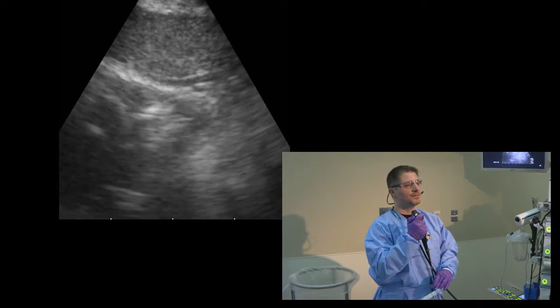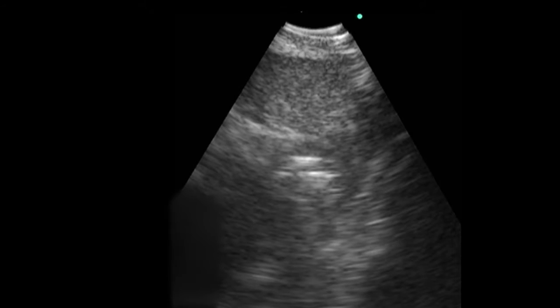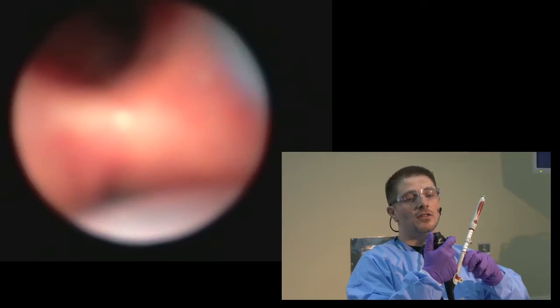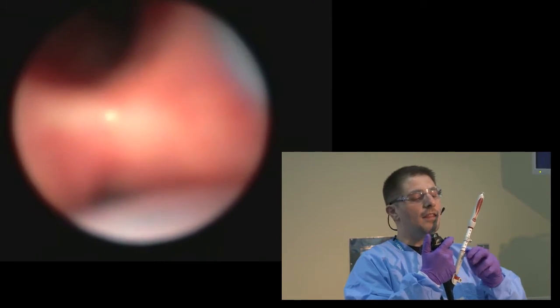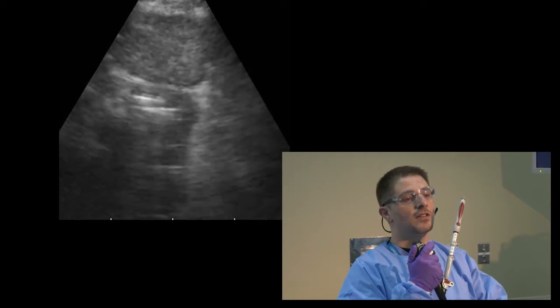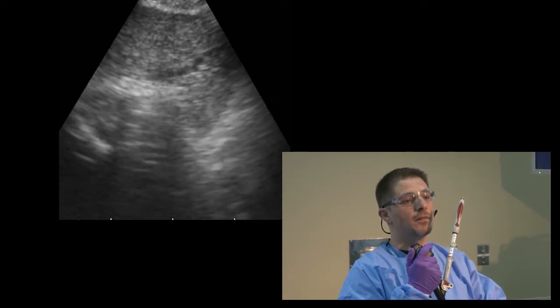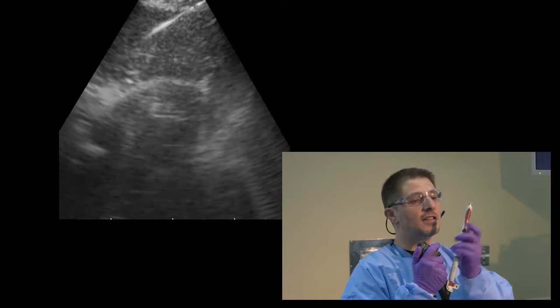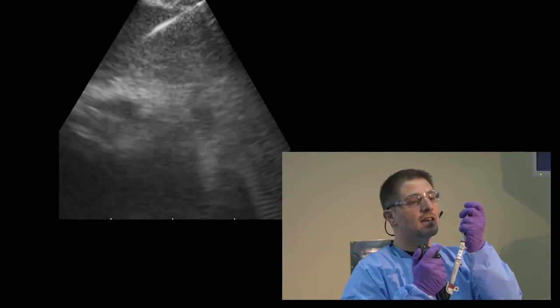Can you freeze, please? We'll do the measurement now. Station 7 is 10.3 millimeters out of the scope. Then you set up your needle. You go at the carina from the right side, and you see your lymph node now in the endobronchial ultrasound. Then you pass your needle, and now it's very easy to identify the shadow of the needle inside the lymph node.